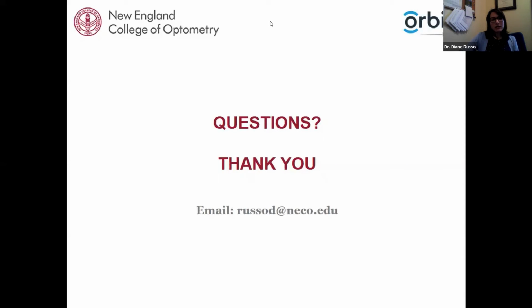Can the astigmatic fan help to refine cylinder axis in case of indecisions? Yes, definitely. For purposes of this lecture and the scope of the lecture, especially based on the amount of time that we had, I did not cover the fan chart. There's also the stenopeic slit. There are a few other techniques that you can use for cylinder axis refinement. Absolutely, that is an option. And if you have that as an option where you are, I would suggest using that.